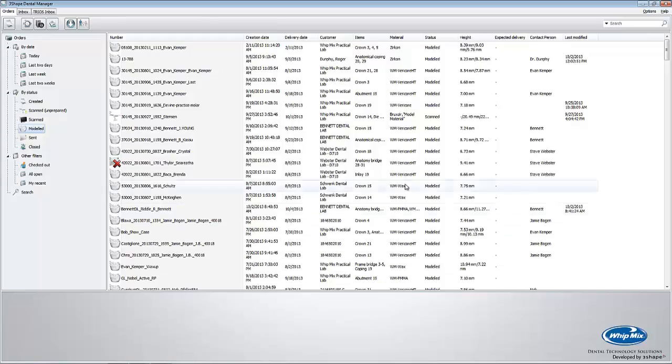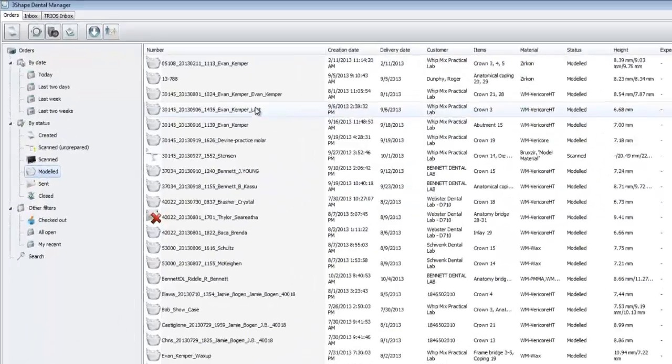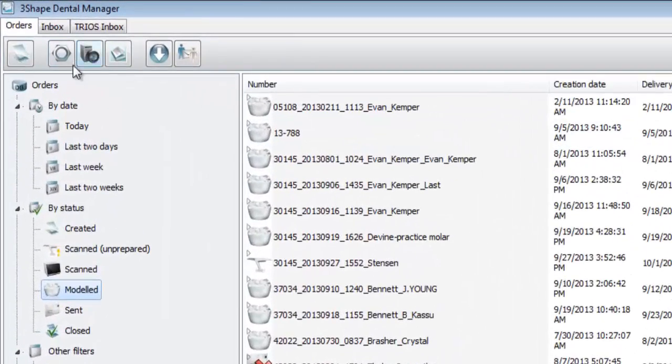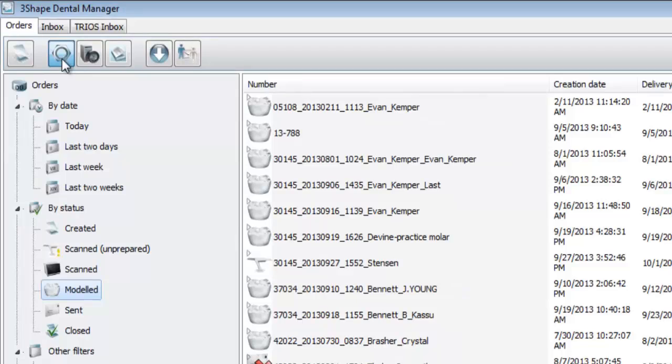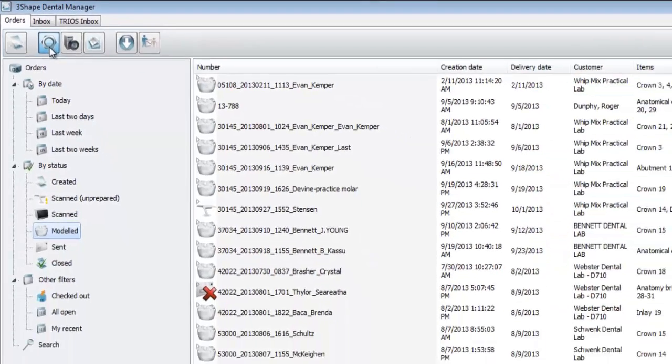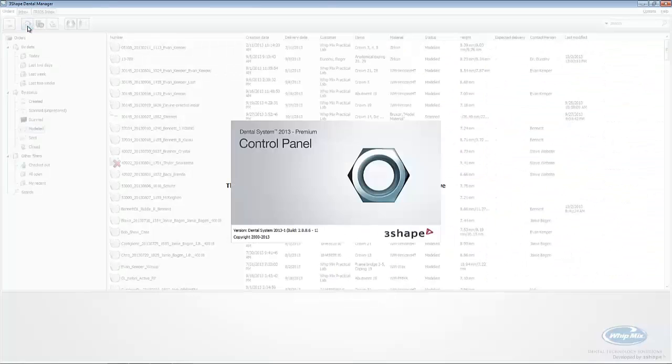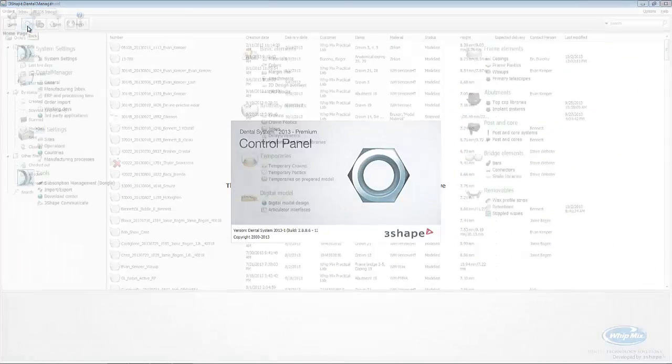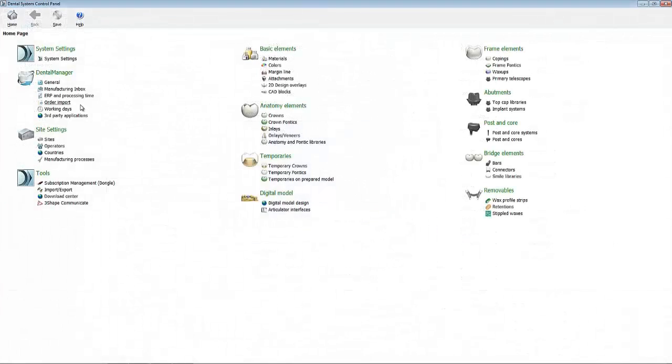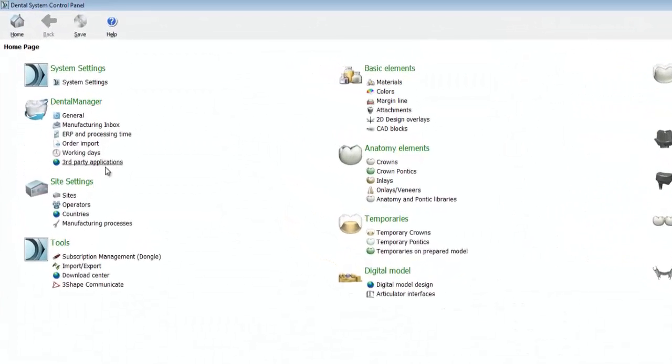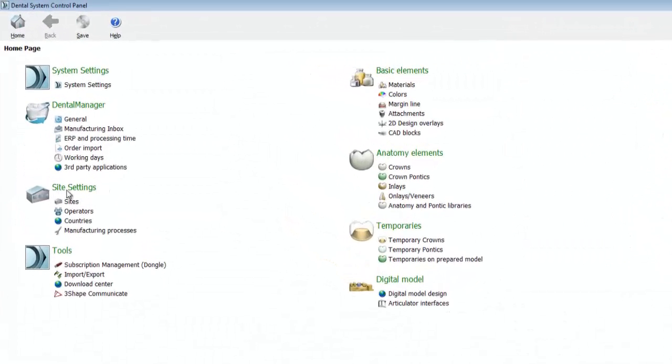Next, we're going to click on the control panel icon, which is at the top left hand corner of the screen. Once the window loads, we'll see a category called site settings. Make sure to click on operators.